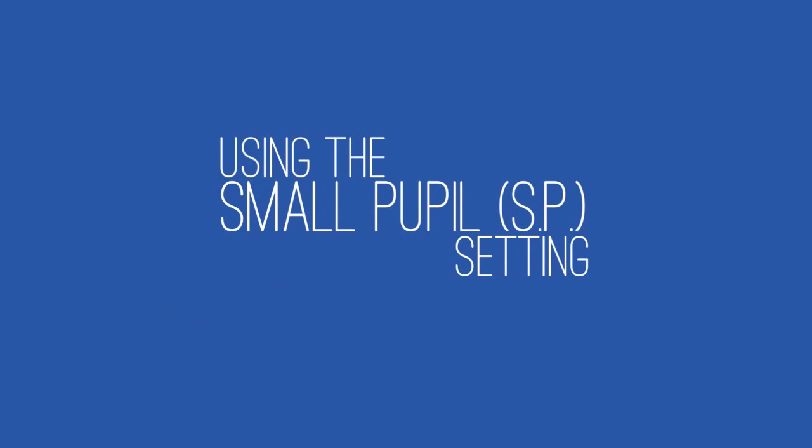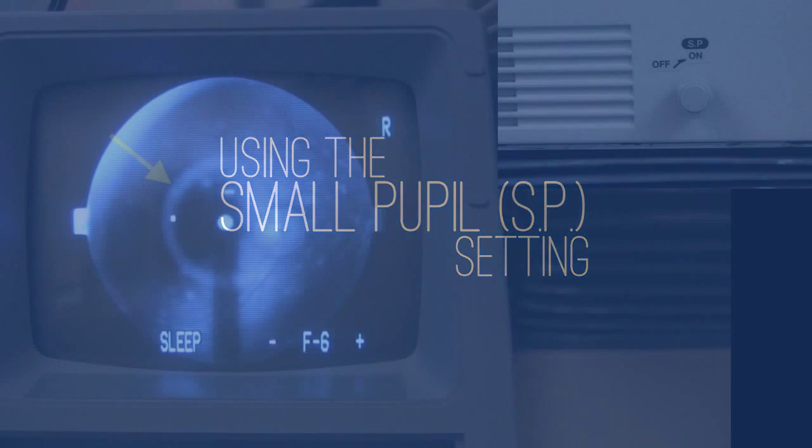Our recommendation is to leave the small pupil setting in the off position unless it is necessary to avoid small pupil artifacts. If, however, the small pupil artifacts are interfering with retinal photography, the small pupil setting can be utilized to minimize shadows obscuring key portions of the photos.